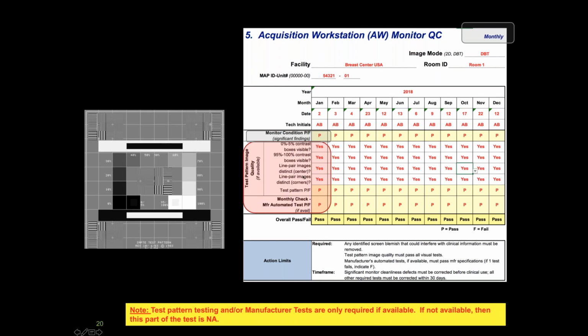If you have the ability to do a test pattern, you bring up a test pattern like you have before on most other systems, and you evaluate the test pattern. And if systems have a built-in QC program, like a lot of the radiologist workstation monitors do, then you would verify that the monitors have passed the manufacturer test.